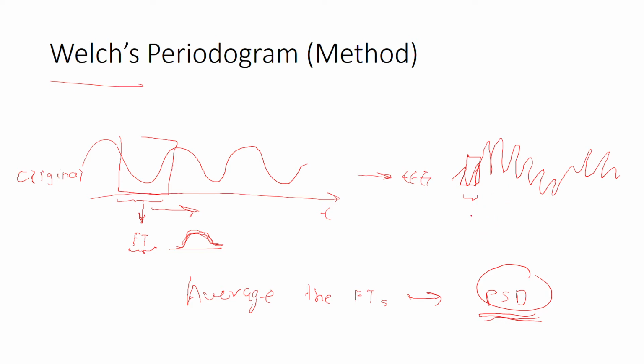So how do we define the optimal window duration? A commonly used approach is to take a window sufficiently long to encompass at least two full cycles of the lowest frequency of interest. For instance, in EEG data, remember that there were four frequency bands.